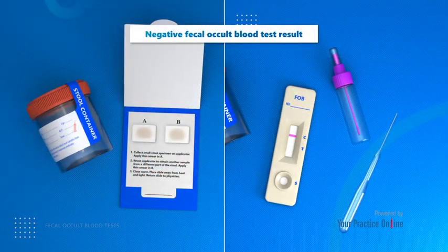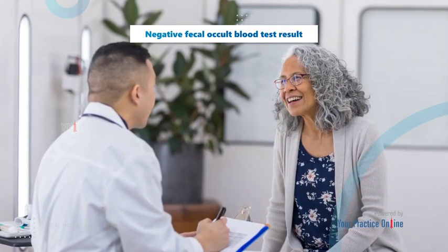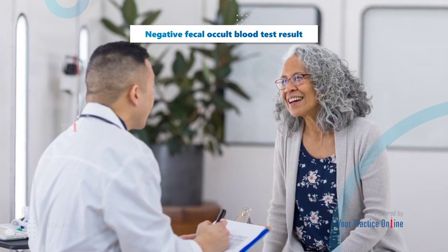A negative test result means no bleeding was noted during the testing period. However, you should follow your doctor's advice regarding regular screening to evaluate your condition.